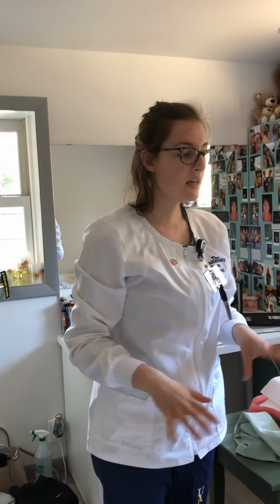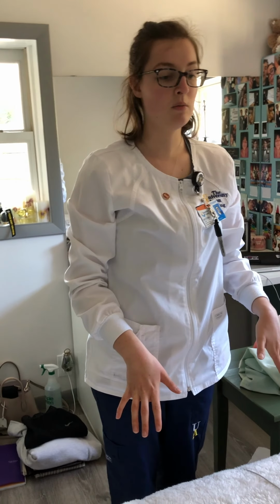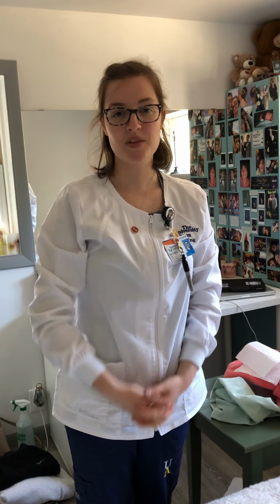I'm just going to quickly assess the patient, make sure they're not in any pain, that everything feels as comfortable as it can be. I'm going to lower the bed down to its lowest position, and make sure their call light's within reach. Then I document my care, and again, make sure everything was cleaned up and the room looked okay, and yeah, that's it. Thank you.